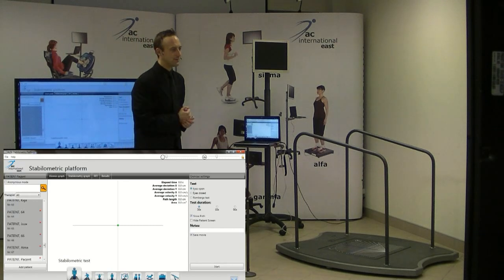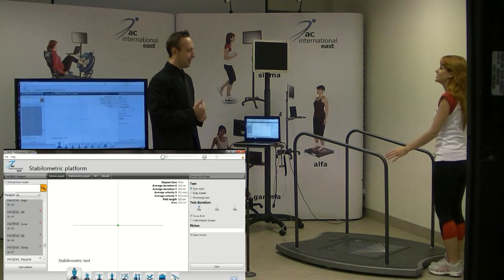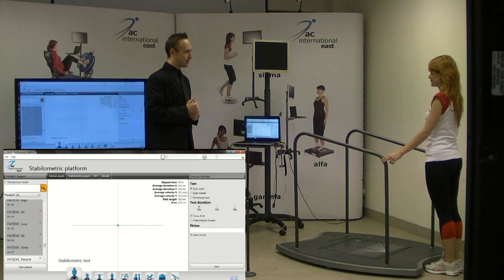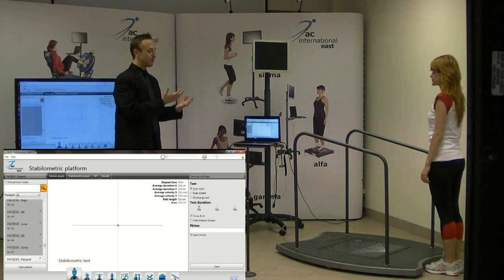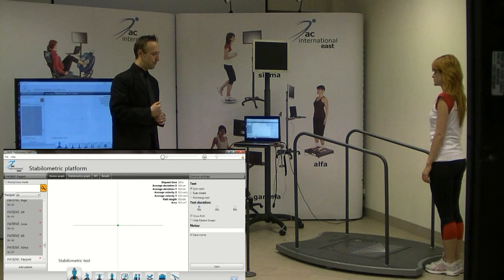Here we have a patient, Angelica, welcome. Hello. So you will be our patient. Okay, we'll do the assessment and training of your balance on the platform.